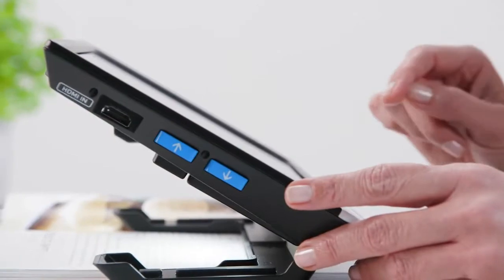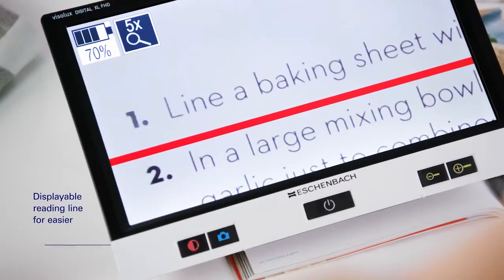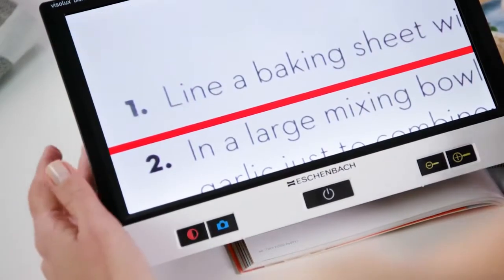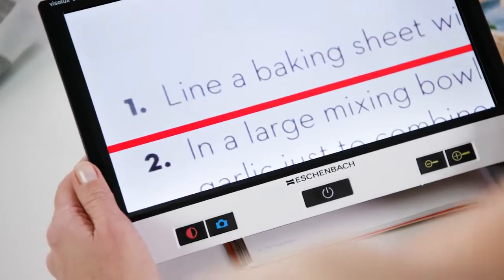For better line orientation, you can optionally switch on a reading line or reading blinds.